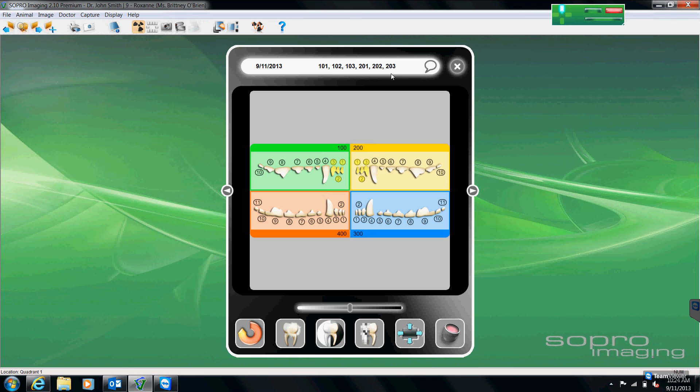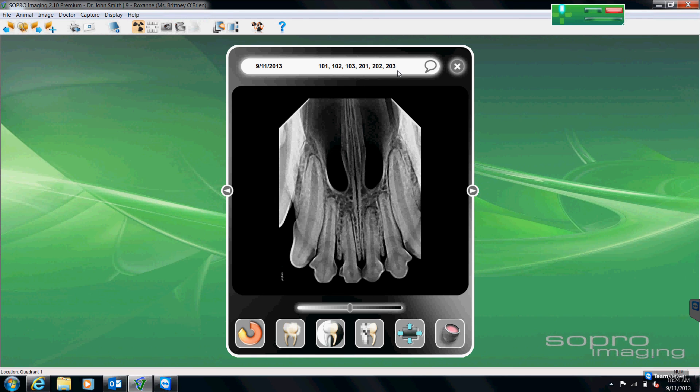When I'm done, I simply click on that location bar once more to close out. And now my teeth are numbered for me up at the top.